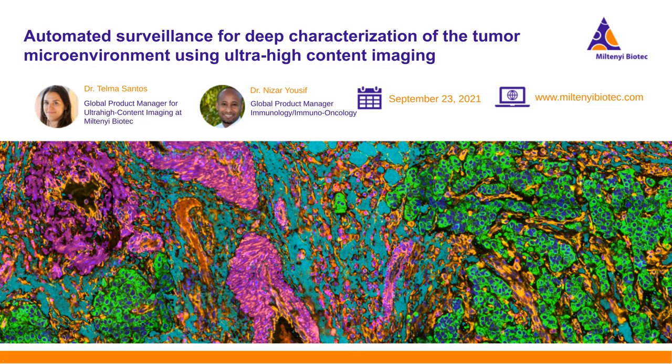This way we are removing most of the signal that is still maintained, that can come from autofluorescence or anything that might be got after it. But you have access to all of these images, so you can follow up how good the run has been. But in principle, when you have your images ready to analyze, all the autofluorescence and some background signal has been removed.